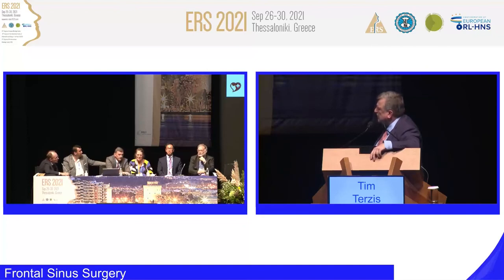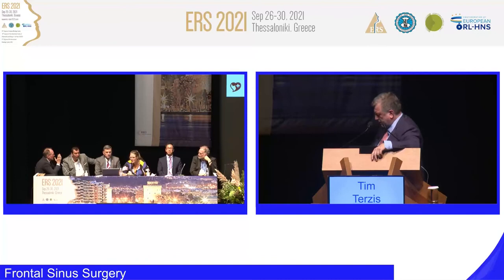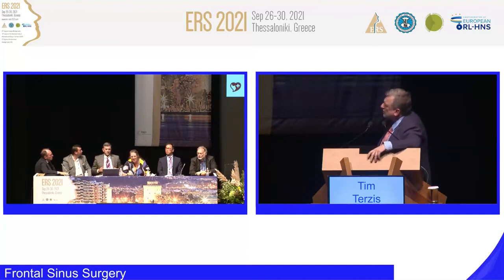It's possible. Okay. And I would always be worried about the bony erosion on the posterior table of the frontal sinus. So this looks like something you have to think very carefully about. Okay. Don't you think that's a partial volume effect? I don't see a bony erosion. Well, you should need the full set, but I don't think so.